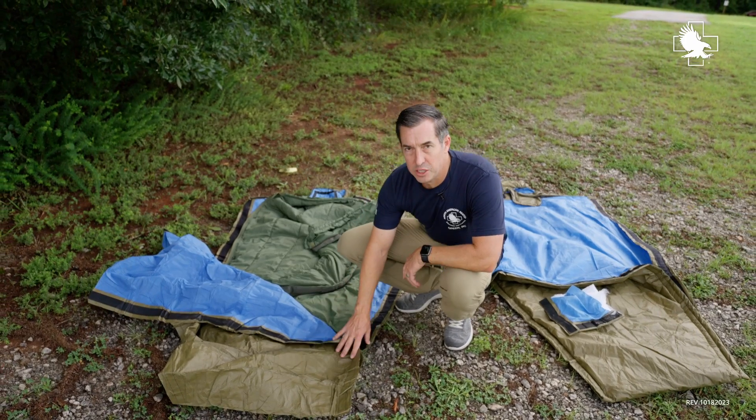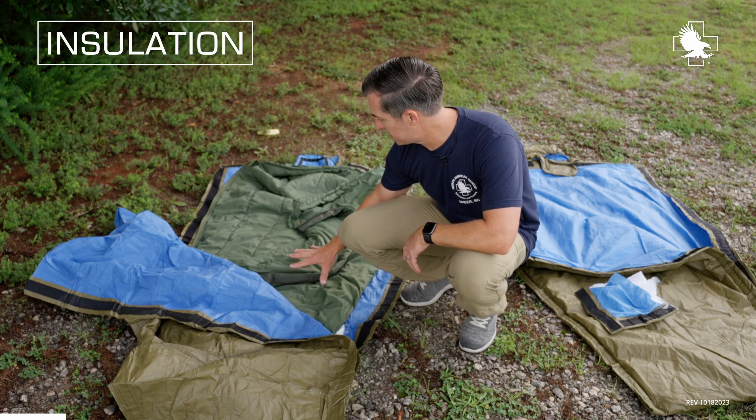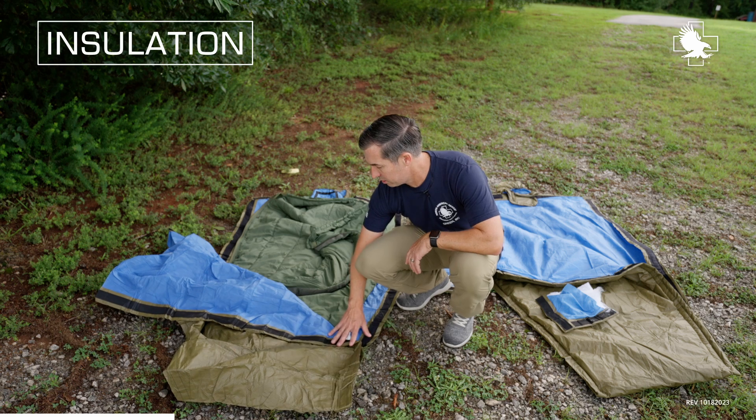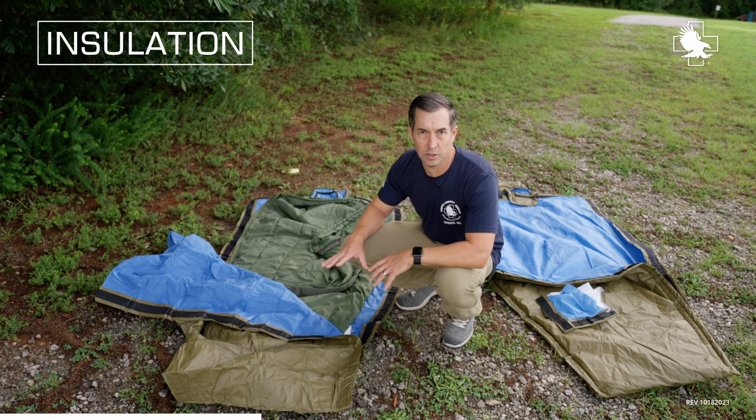What I have here is the standard HPMK with the TC3-recommended layer of insulation — in this case, the standard issue army green sleeping bag that we all know and love. So we've got our shield, we've got our added layer of insulation for the patient. Makes a really great setup.